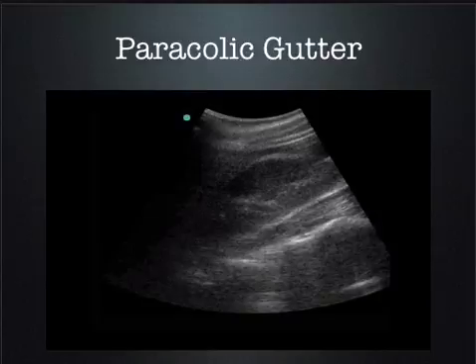If I come in walking and I've got blood or fluid in my abdomen, what view am I going to see the fluid? Here I am, I've got a liter of blood in my belly. What view am I going to see the fluid? The bladder, because the fluid is down in my pelvis, right? If I lay down, and I've been laying down on my ambulance ride in from South Georgia, right, where's the fluid going to be? Right upper quadrant, because that's the deepest part of the belly, okay?